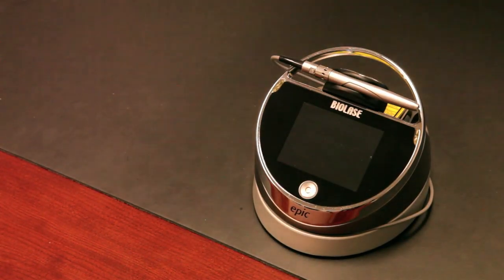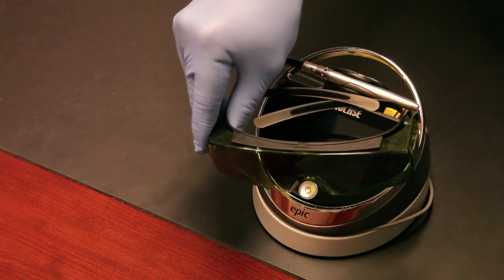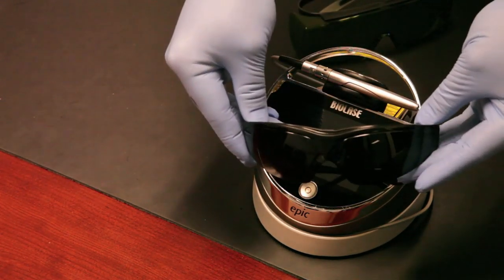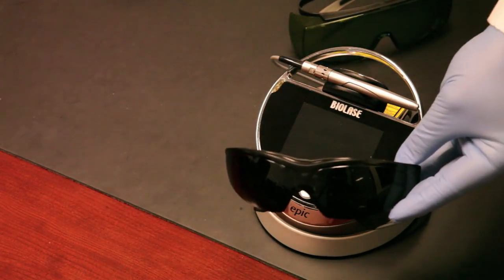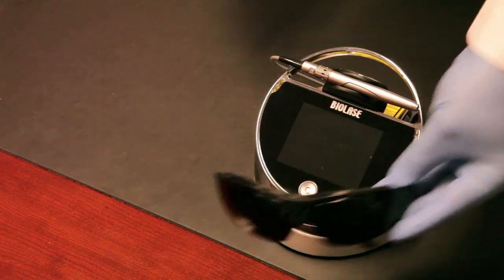You get three pairs of safety goggles. Two pairs are diode protective goggles against the wavelength, and there's a darker pair for the patient. We found that the darker pair is better for the patient — they can relax during the procedure, and it provides more protection with the darker lenses.